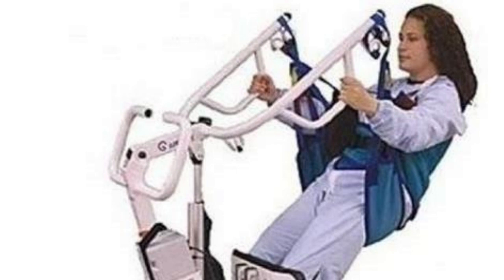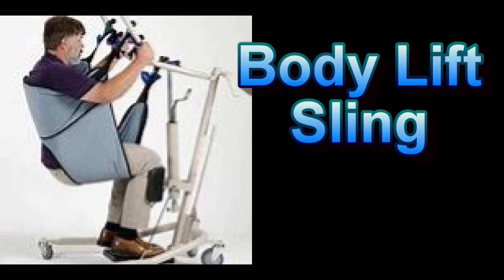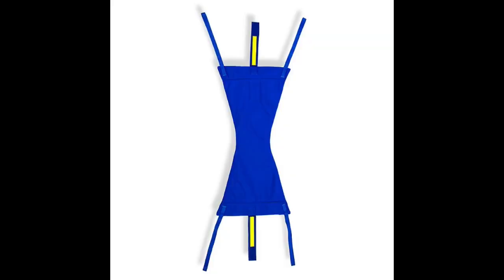This butt sling is one of the many types of slings that can be used with a sit-to-stand lift. For advanced stage IBMers, a full body toileting sling can be used, and there are even special slings designed to help your caregiver roll you over in bed.